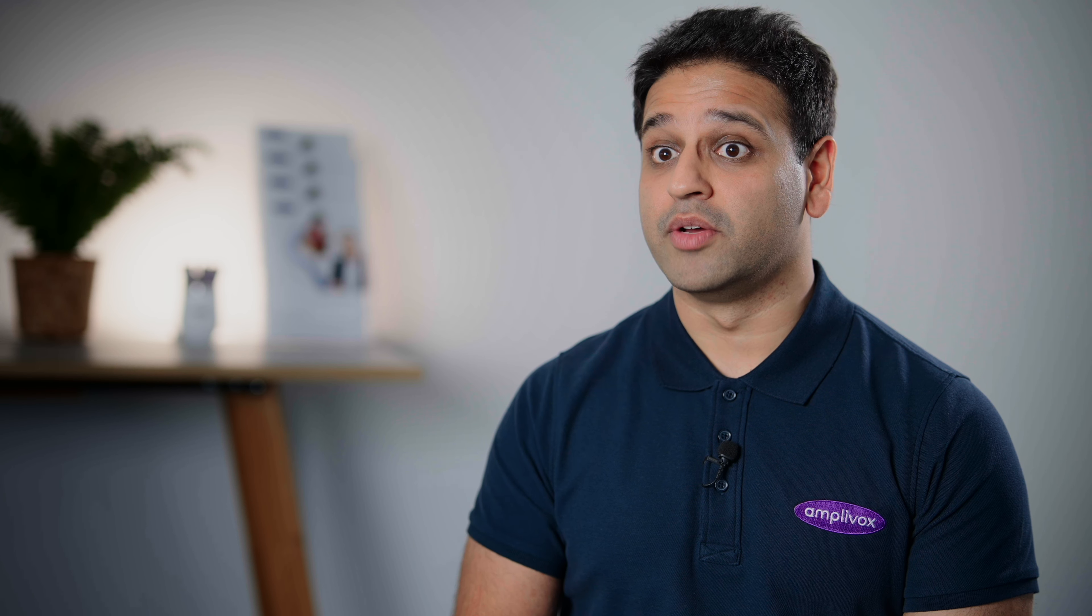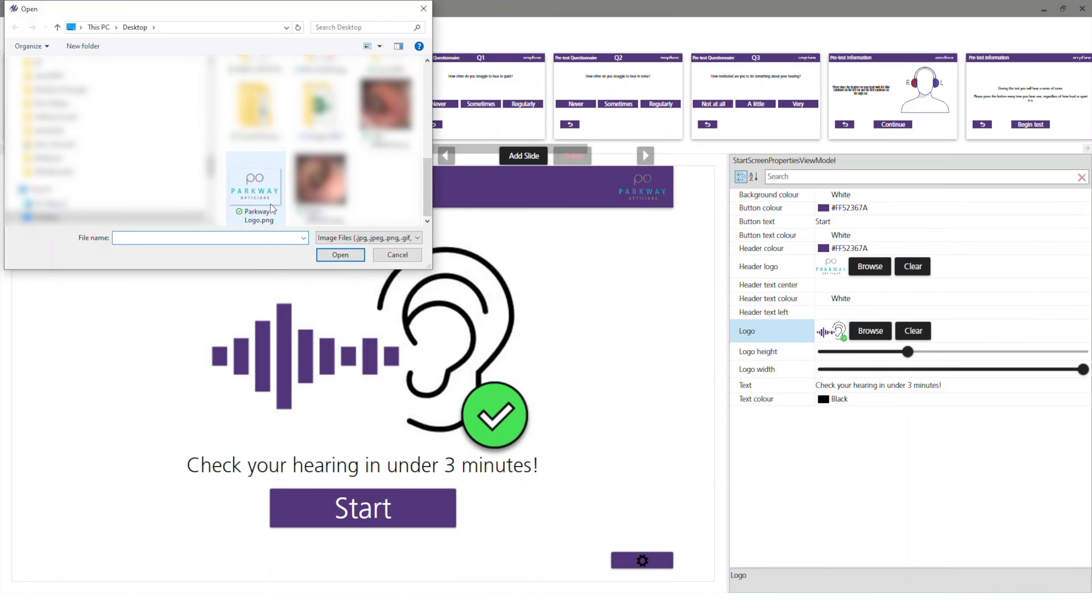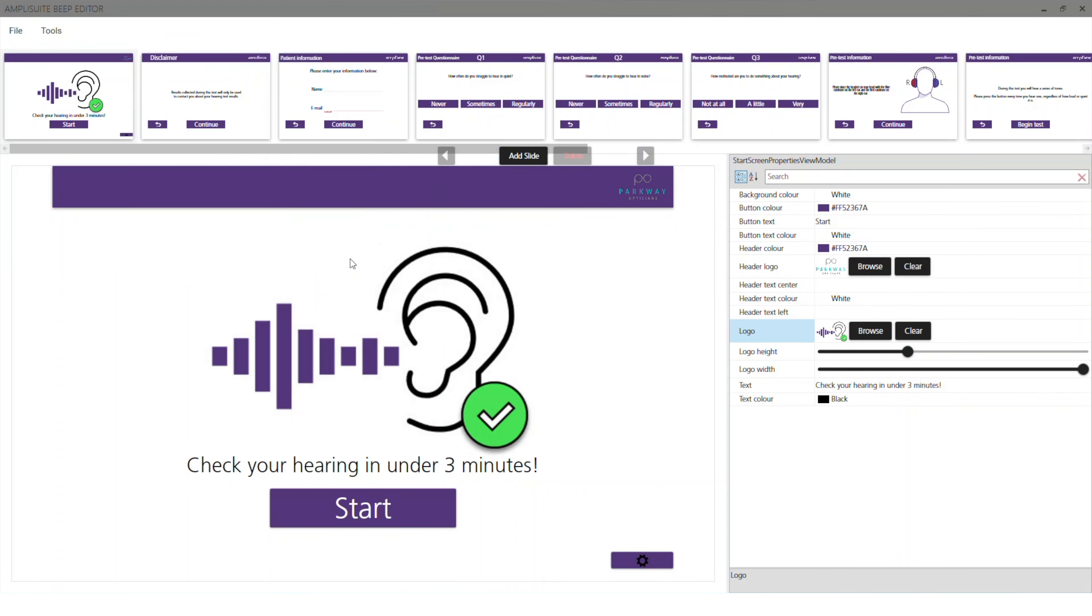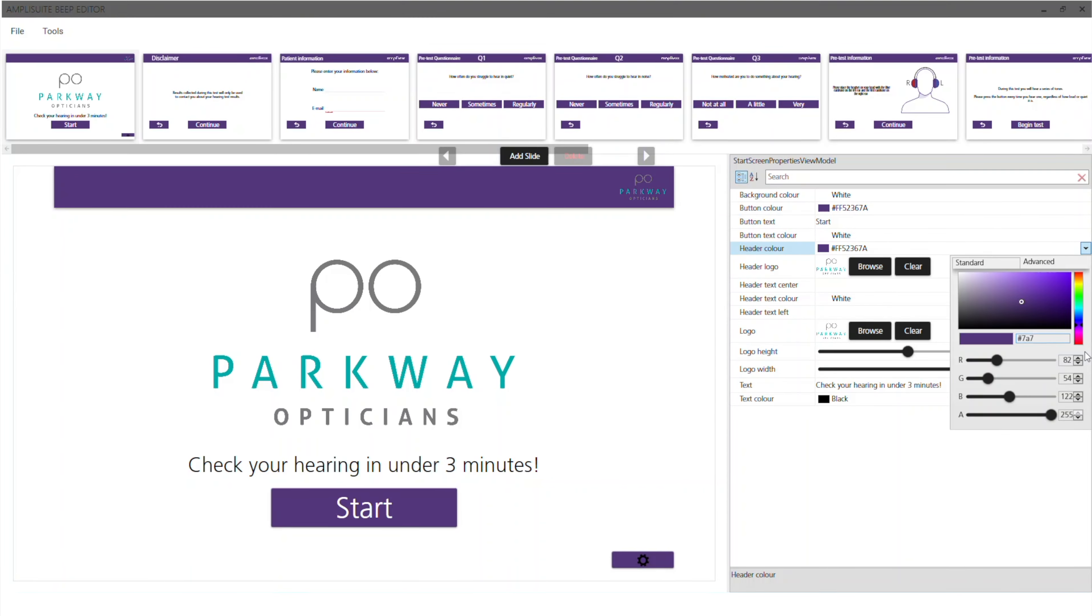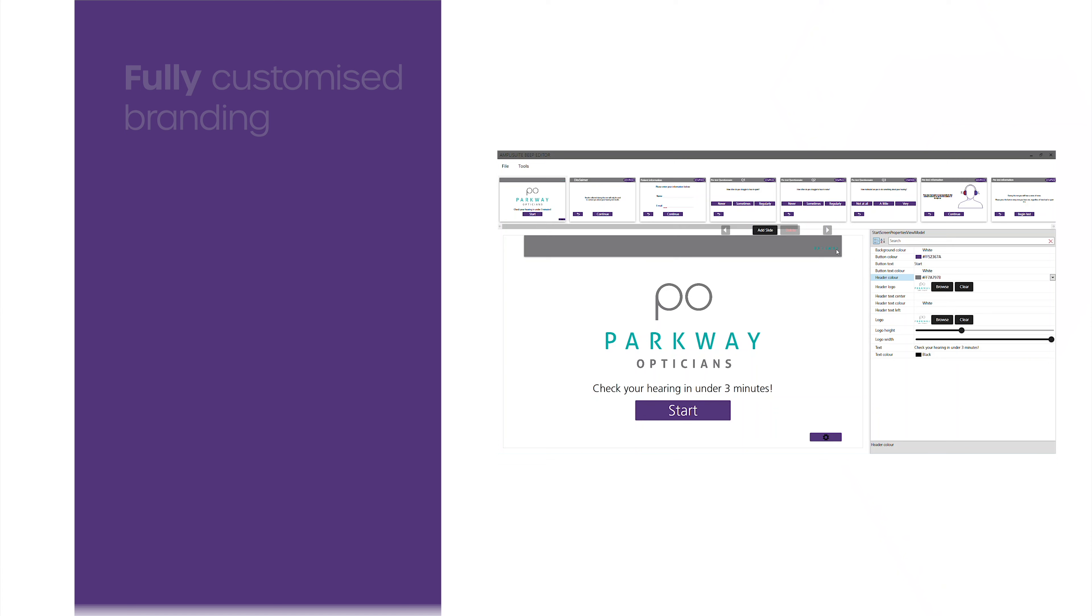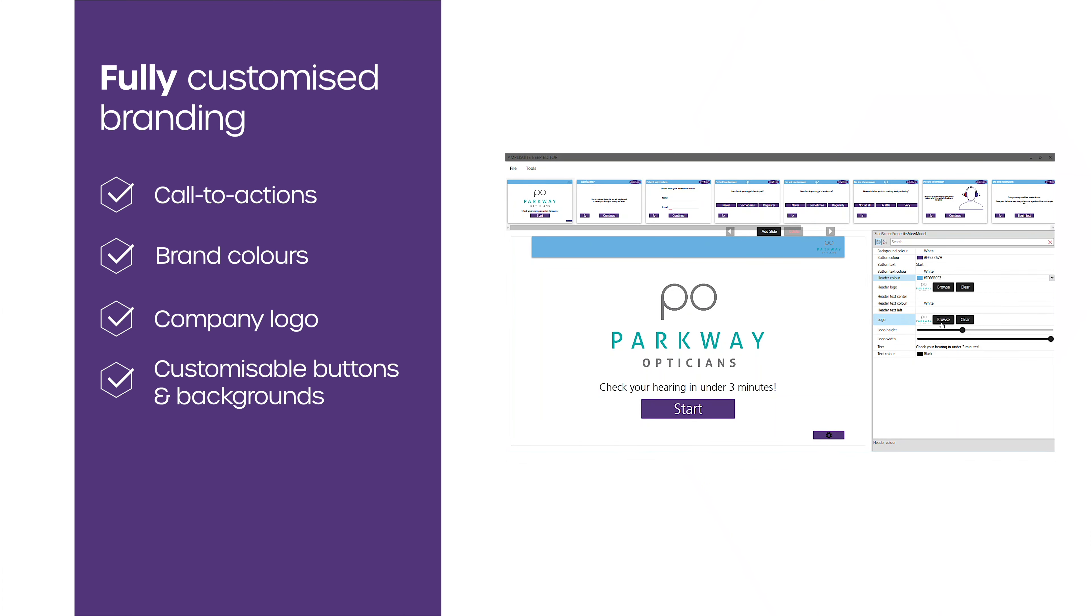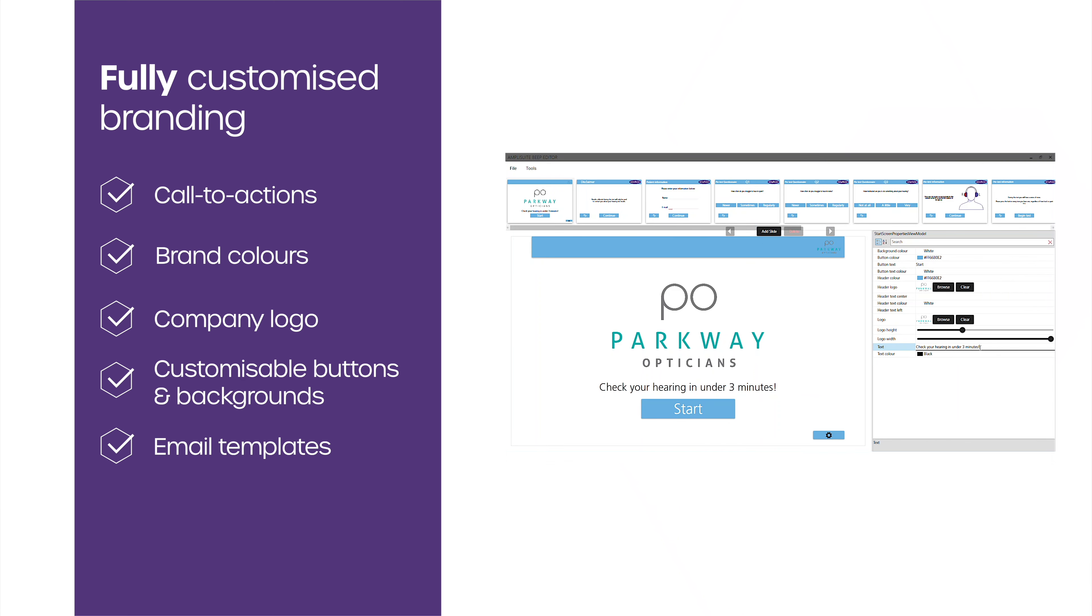It's essential for owners not to miss the benefits that personalized branding can deliver. Device owners can personalize the user interface to create professional and bespoke user interfaces including call to actions, brand colors, company logo, customizable buttons and backgrounds, and email templates.